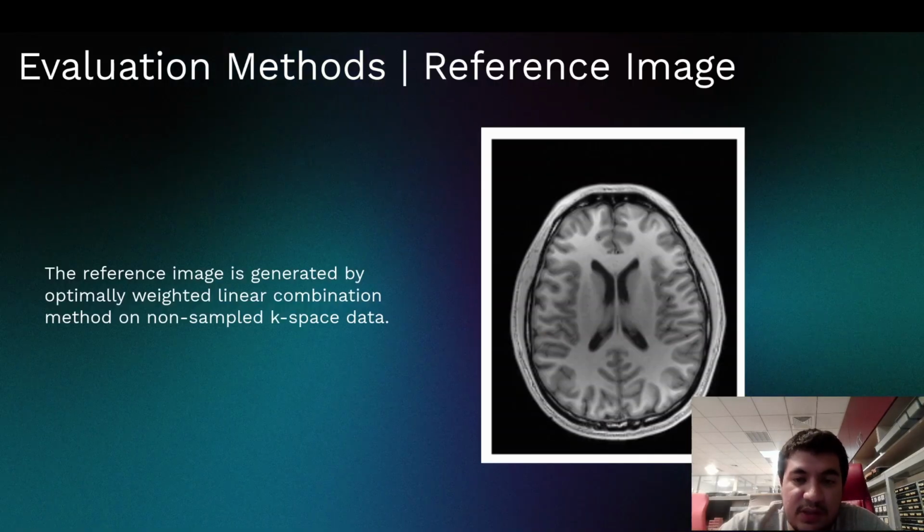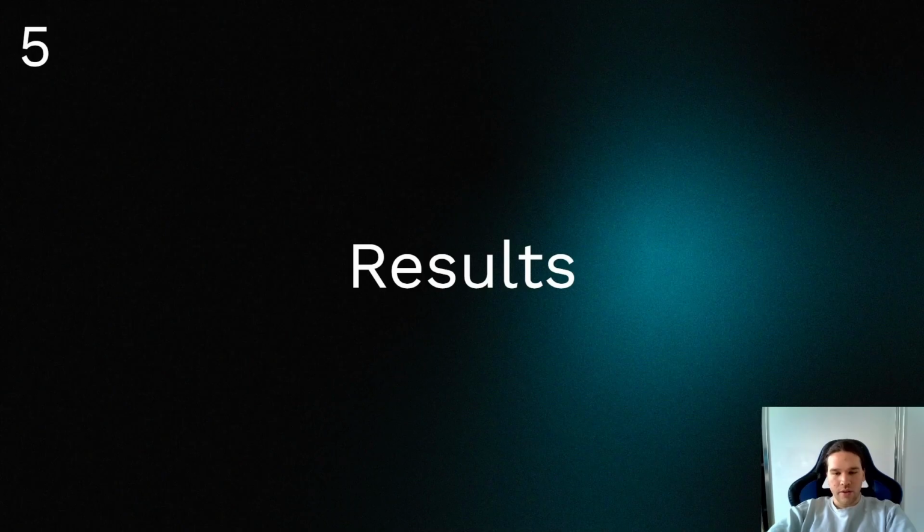The reference image looks like this, and it is generated from the full k-space and reconstructed by the optimally weighted linear combination method. The image is also included in the data provided with the k-space. Now I will be moving on to the results.